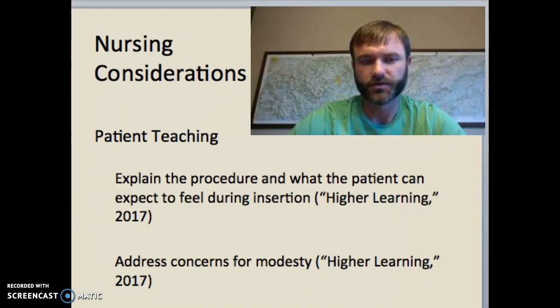The nurse should also address concerns for modesty. Explain to the patient that they will be exposed during the procedure. However, reassure the patient that a blanket will be used to cover their legs and the curtain will remain closed to provide privacy.